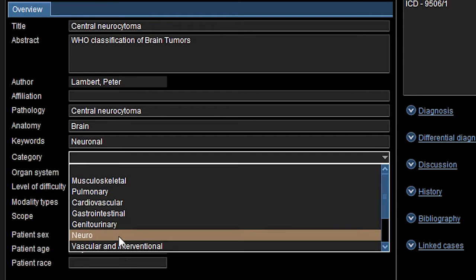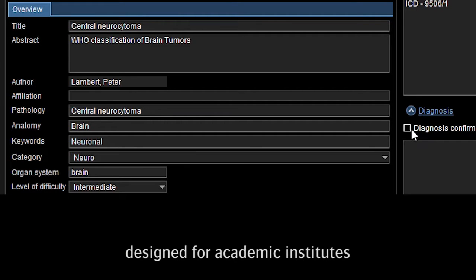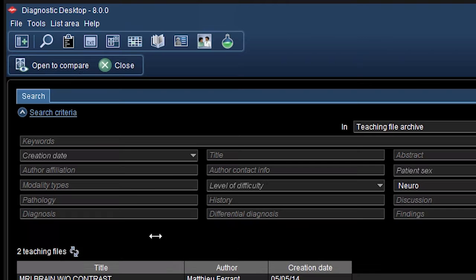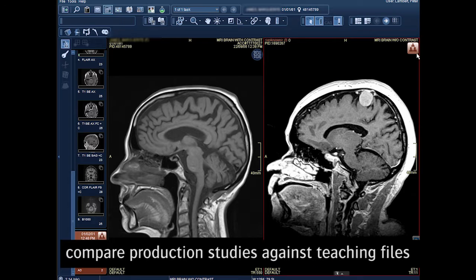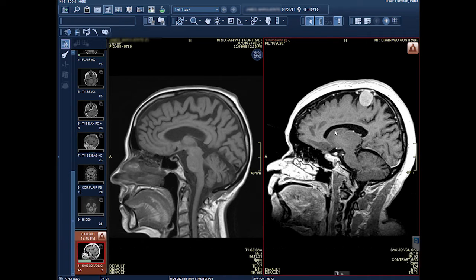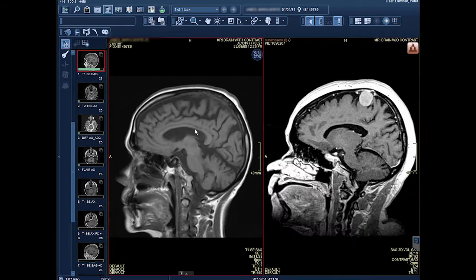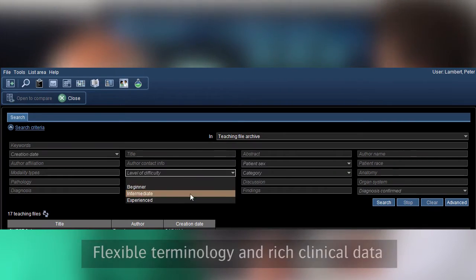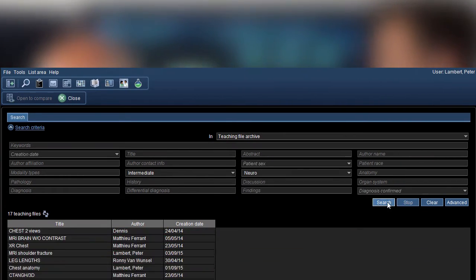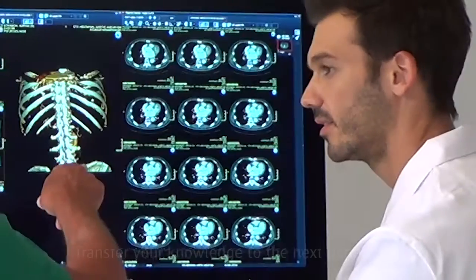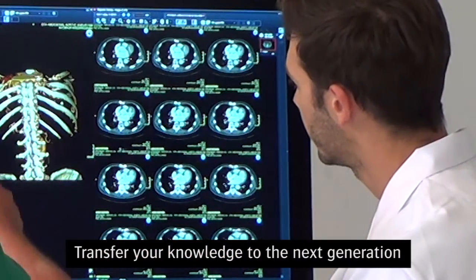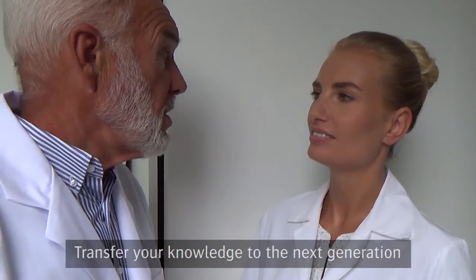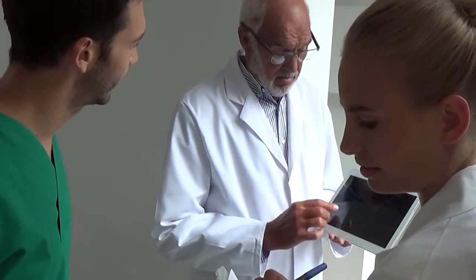Agfa Healthcare's Enterprise Imaging for Radiology is designed for academic institutes. The solution lets your residents compare actual production studies against the teaching files at any moment using a powerful display protocol. Flexible terminology and rich clinical data make it easy to find previous studies and research reports. You can share and transfer your knowledge to the next generation and be assured that you're contributing to the continuity of the delivery of care and education for the future.